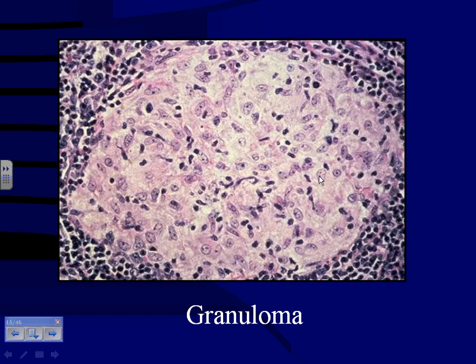What does reniform mean? Kidney bean shaped. And see, doesn't that one look like a kidney bean? They have indistinct nucleoli here that you can make out, but they're not hugely prominent. And notice their abundant pale cytoplasm. Again, when they aggregate together like this, they stick together along with the lymphocytes. That whole structure, from all around here, this whole thing is called a granuloma, okay?